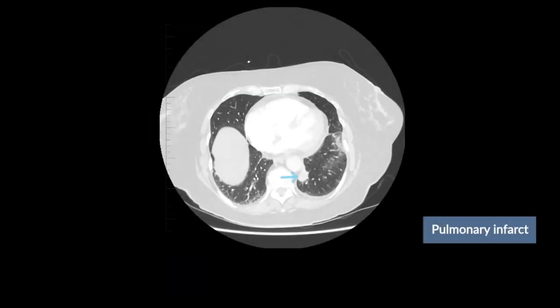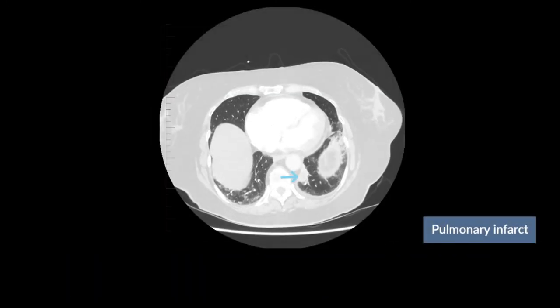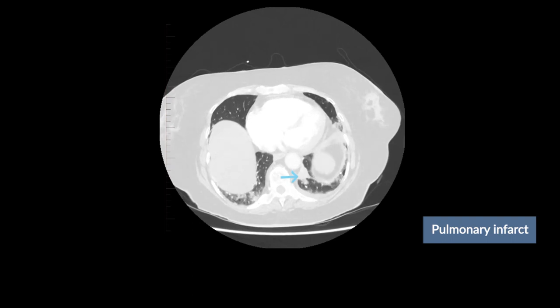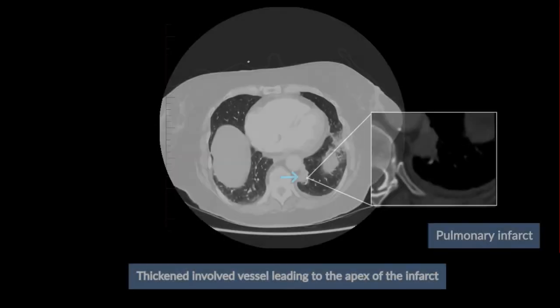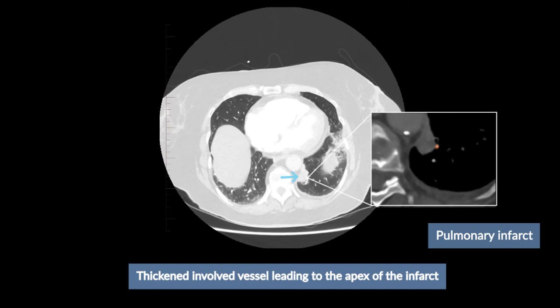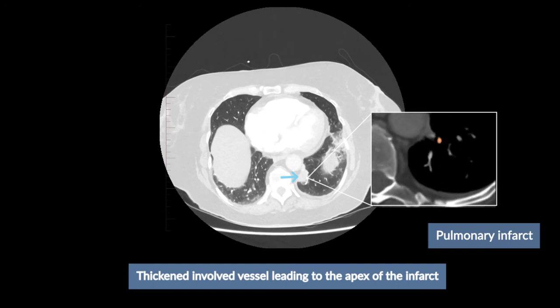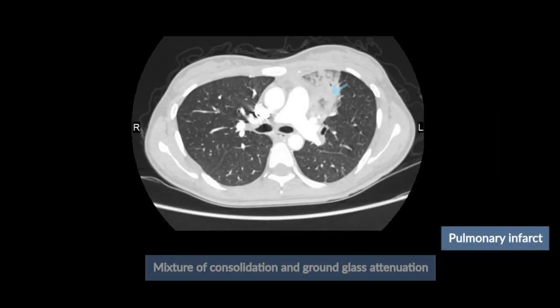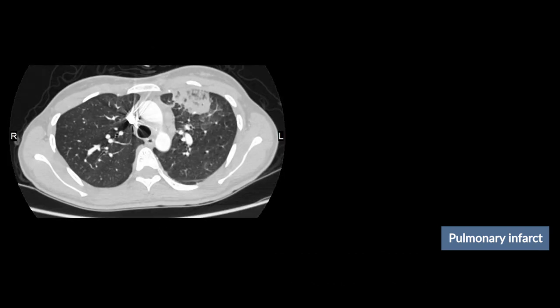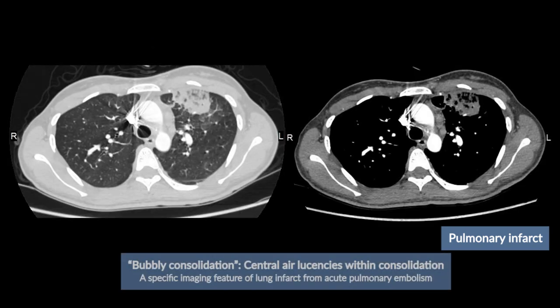Pulmonary infarct typically appears as a region of consolidation or ground glass attenuation that is wedge-shaped or rounded. Look in the region of the lungs supplied by the involved vessels. They can be a mixture of consolidation and ground glass attenuation, and some contain air lucencies inside.